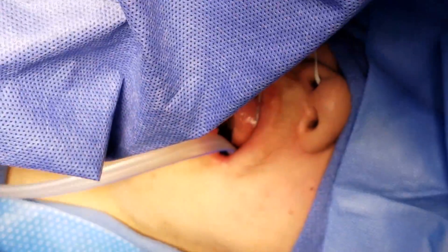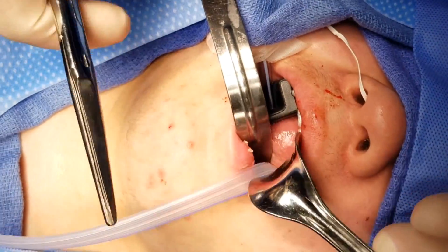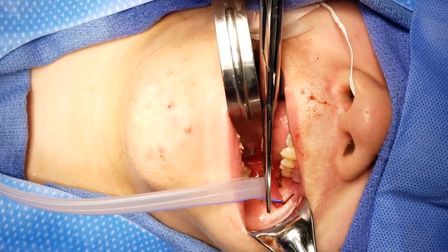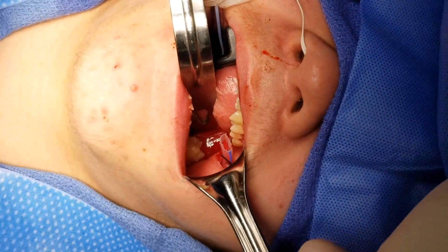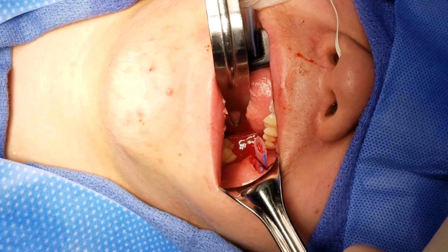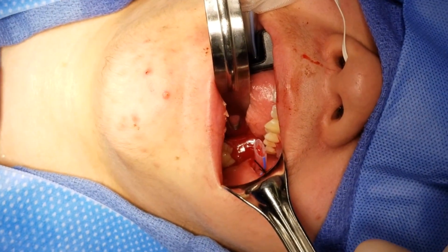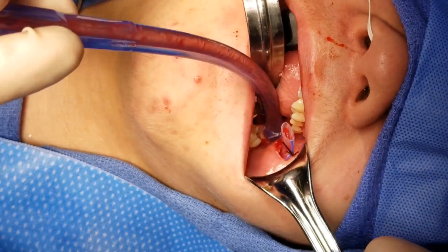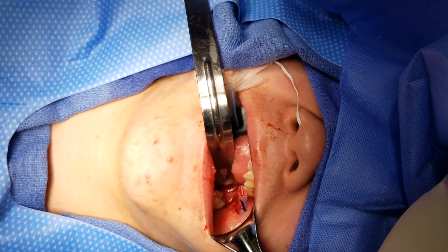Okay, and I'm going to give you that if they'll reload for me. And we will trim this drain to a more appropriate size. Do you want to use this one first, or do you want me to wait for the other one? I'll use it, that's fine. Can I get the tonsil stat again? Actually, the other one's ready. Thank you. Do a little suction in there. I'm just going to irrigate it one more time.